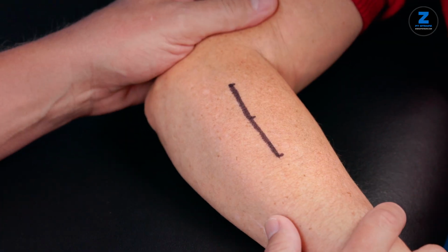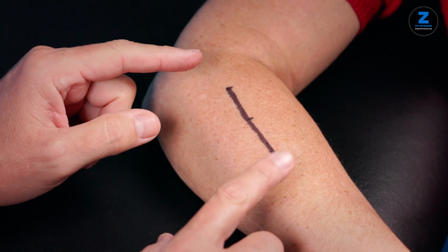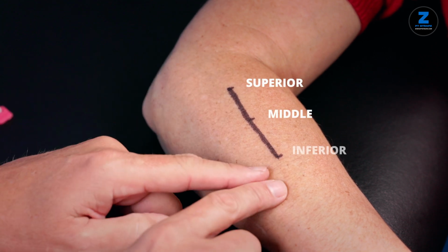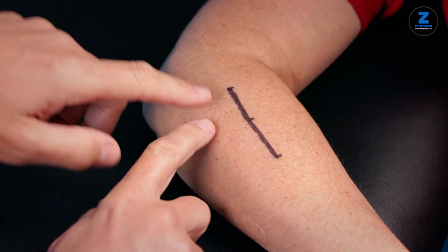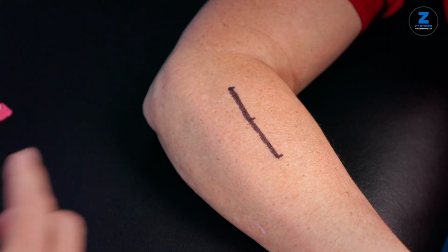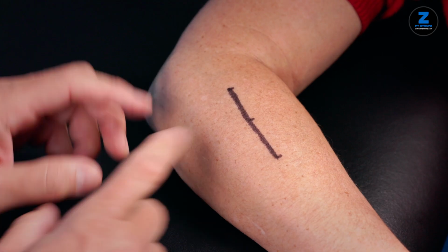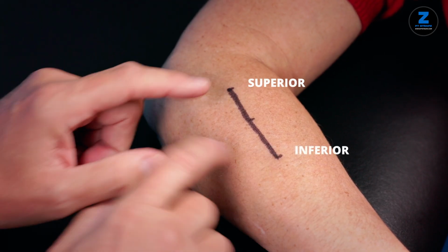So what I like to do is I take the superior aspect, middle, and the inferior aspect of the scar, depending on the length of the scar. If it's a really long scar, like a total knee replacement, then I would use all three: superior, middle, inferior. If it's a shorter scar, then I would just use superior, inferior. For this length of scar, I would just do the superior, inferior, but the technique is sound with any length of the scar. So here, I'm going to use the superior and the inferior aspect.